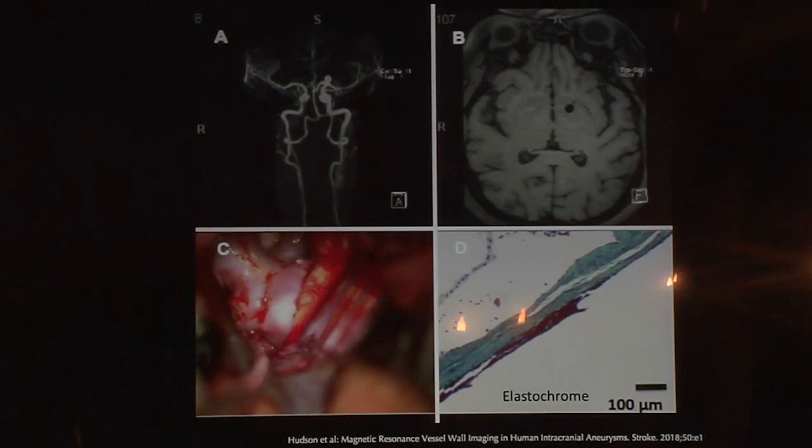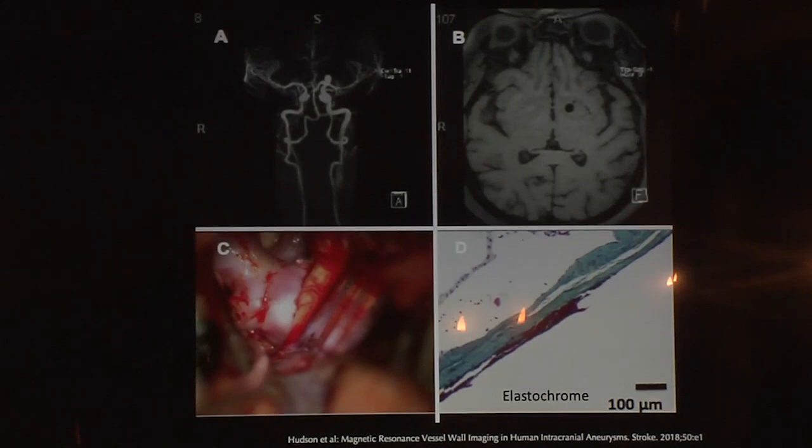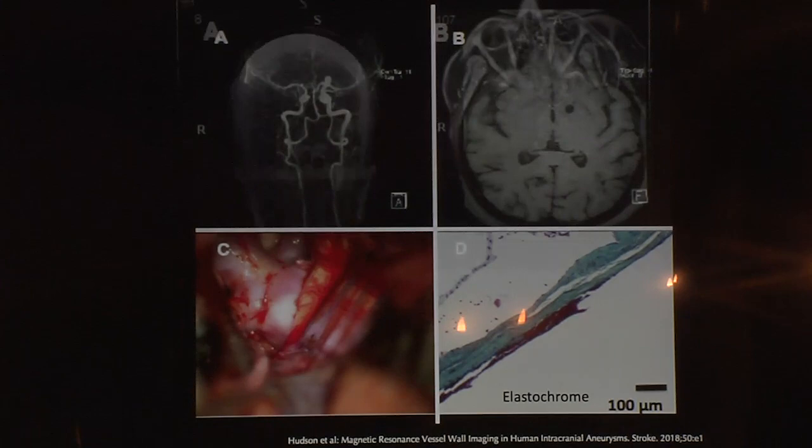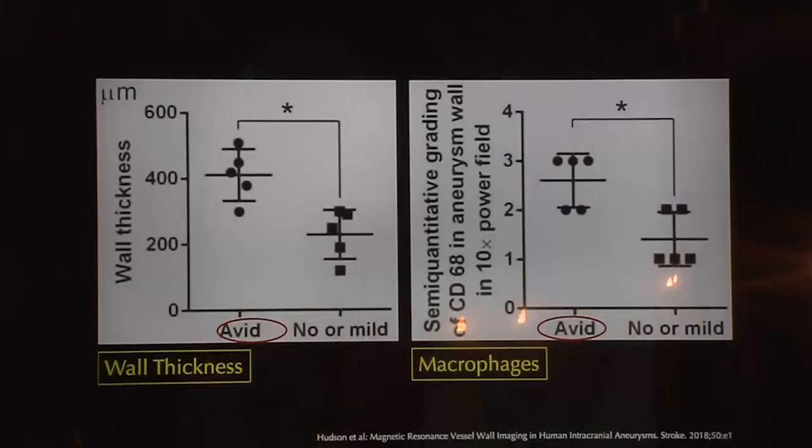This is work done by our group at the University of Iowa. In another terminal ICA aneurysm case, the aneurysm didn't enhance — this was an elective case. We did histological correlation after clipping of the aneurysm. You can see the difference between these aneurysms: those with more enhancement show atherosclerotic changes in the wall that correlate with histopathology.